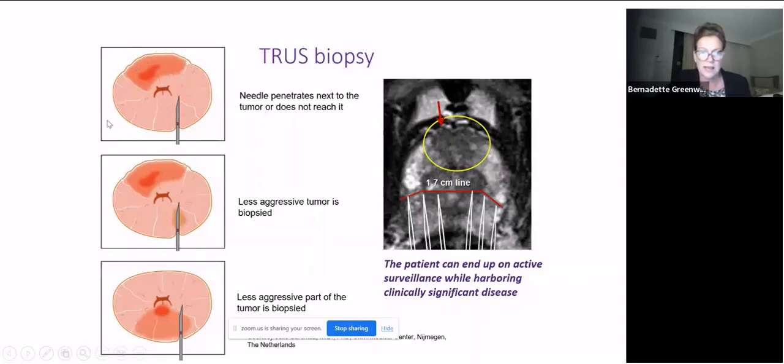So it's not unusual for us to have a patient who presents with high PSA, multiple negative transrectal ultrasound guided biopsies, because simply by virtue of the limitations of the throw of the biopsy gun under ultrasound, you can't go further than about 2 centimeters. Anything further than that, you're going to miss. Biopsy every year for 10 years, you're not going to get it. Unless, of course, it grows so large that it's now in this area within reach.